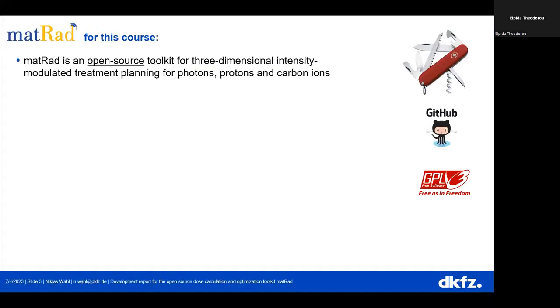So very quickly, MatRad is open source, so everybody can download it. That's a reason why we use it here, because usually you could not get just a license to play around with particle therapy. You can pay one of the vendors, I don't know, maybe 20,000 euros, but I guess that is not very feasible. So that's why we use this open source tool.